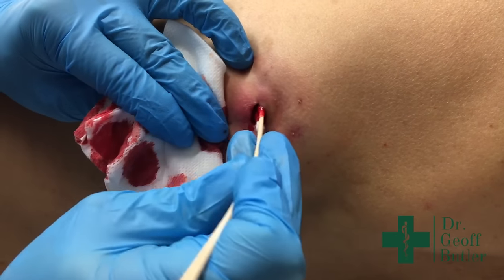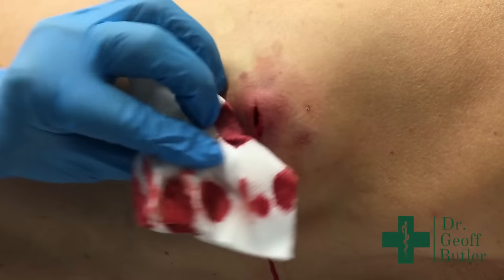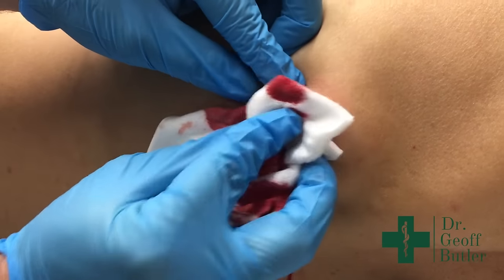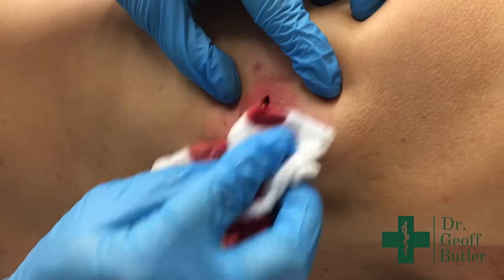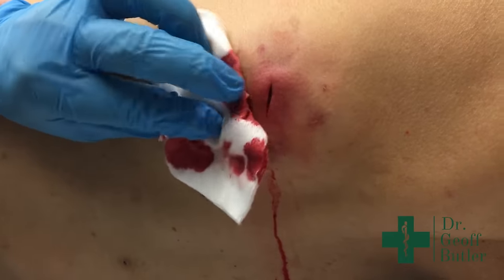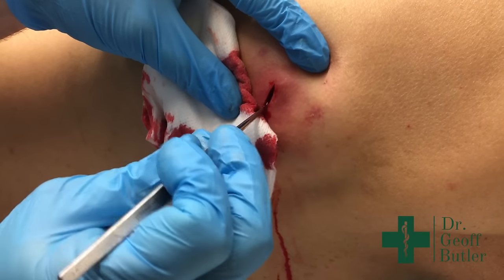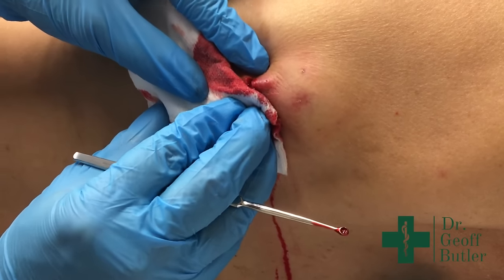You've got that curette all the way inside, right? Yeah, I do. Does it look like there are roots in there? Well, that's what we were talking about — whether this is a cyst inside there — and it looks like there is. Can you shake it out? No, not when it's infected, I can't.